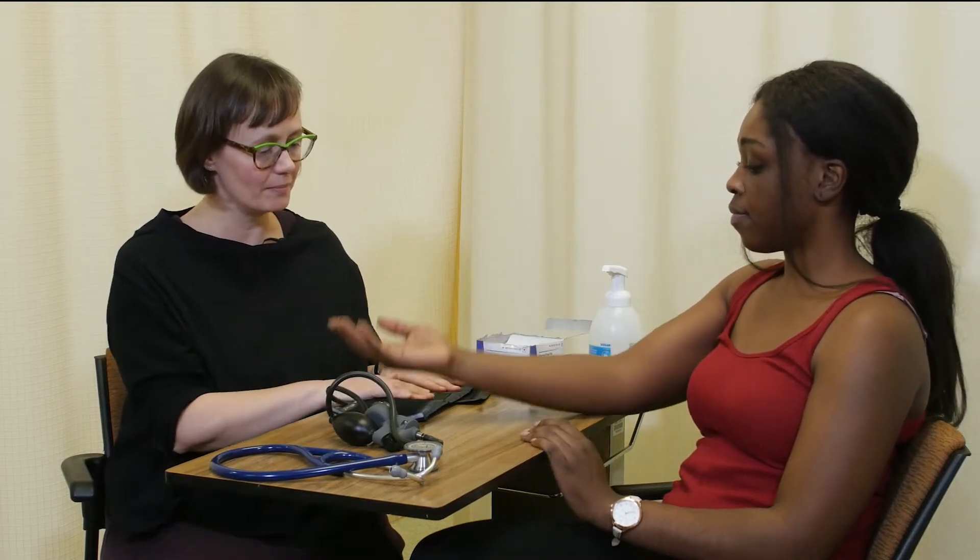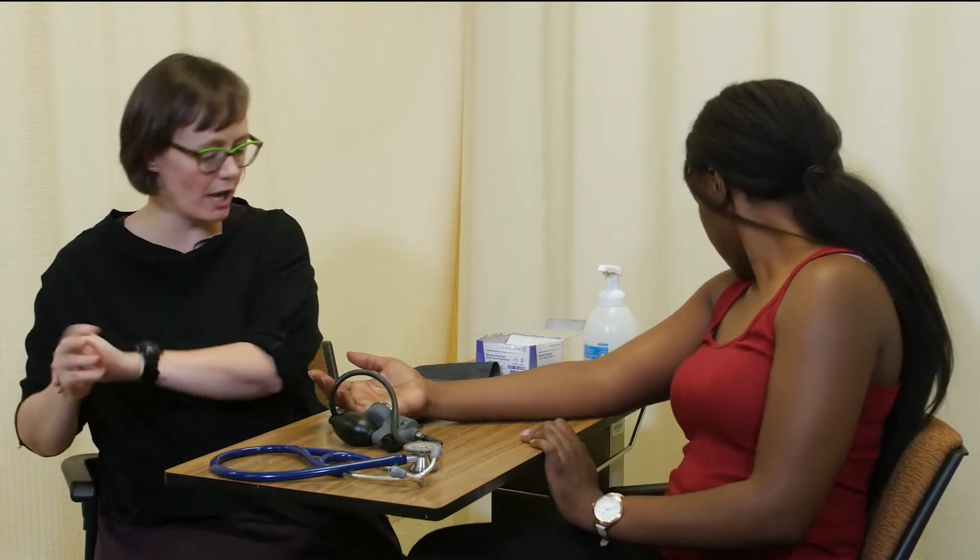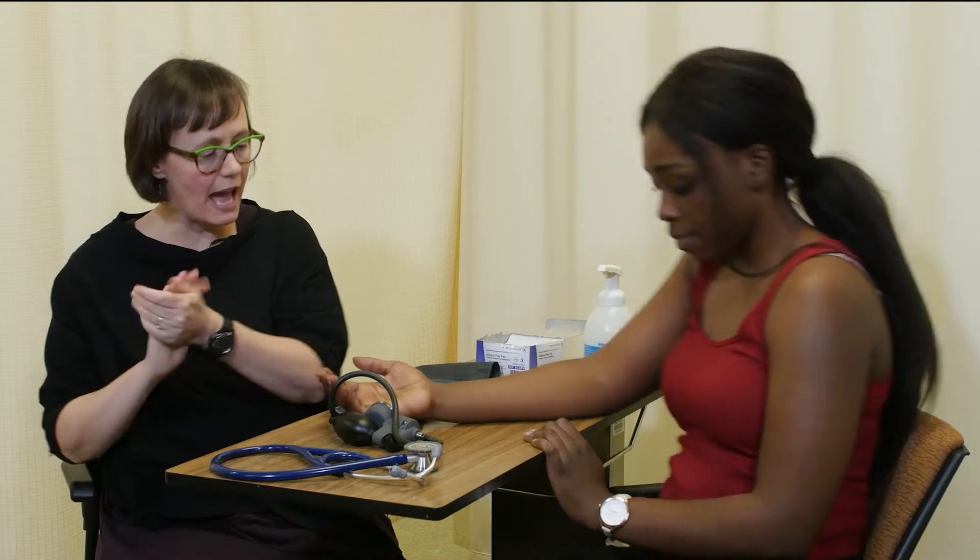So to begin with, I'm going to ask you to put your arm up on the table with your hand up like that. I also would like you to have your back flat against the back of the chair and your feet flat on the floor.